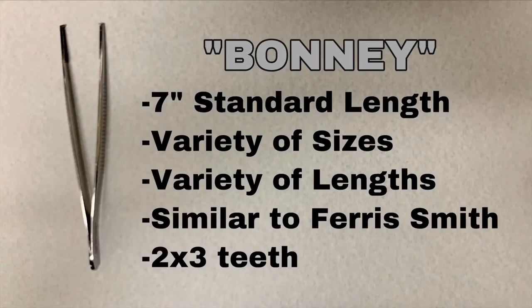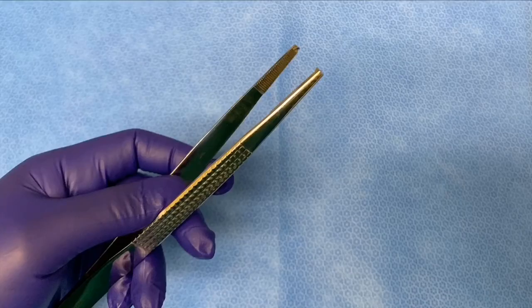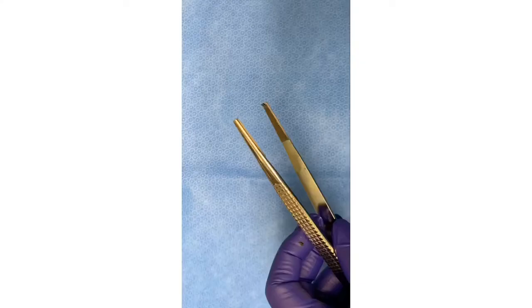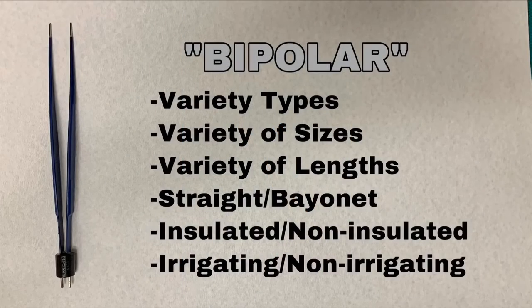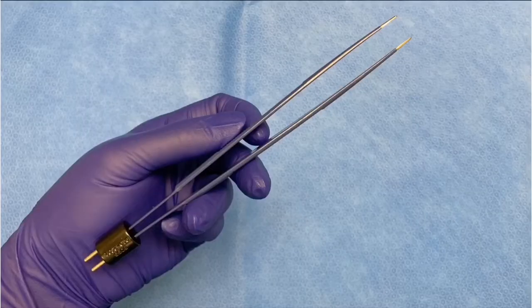This is the Bonney forcep — seven inches is about the standard length. This is the bipolar forcep. It comes in a variety of types, sizes, and lengths. It can be insulated or non-insulated, straight or bayonet, and irrigating or non-irrigating.